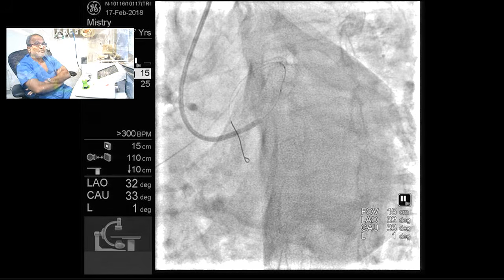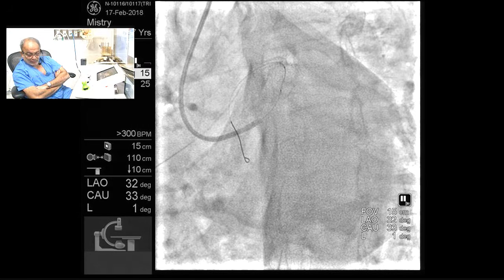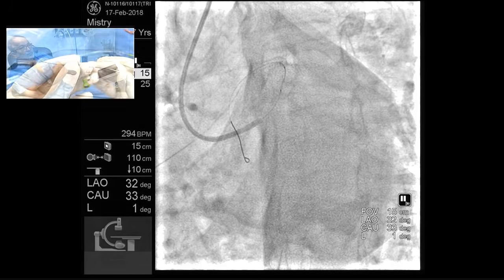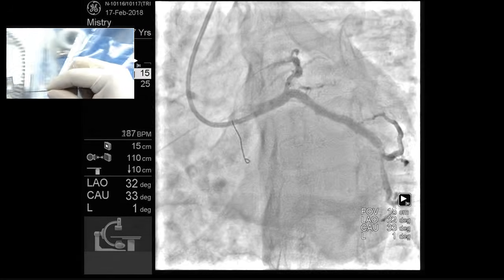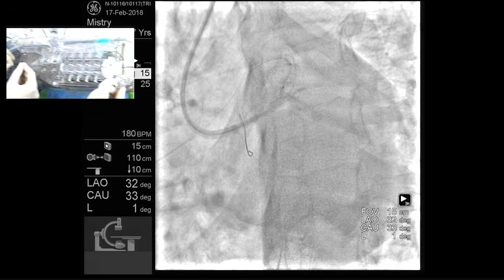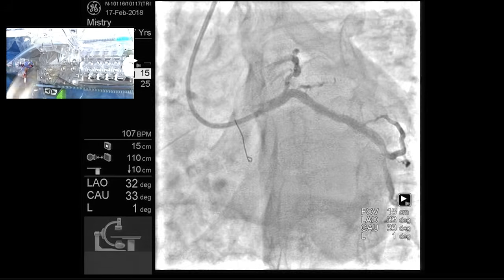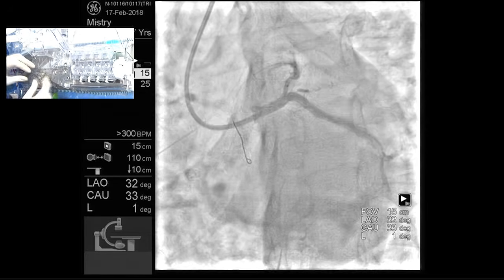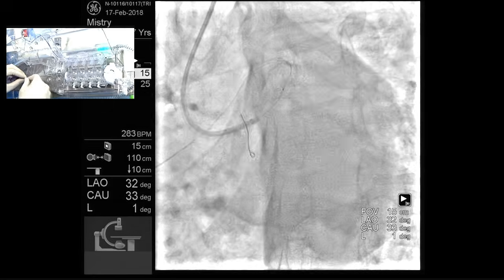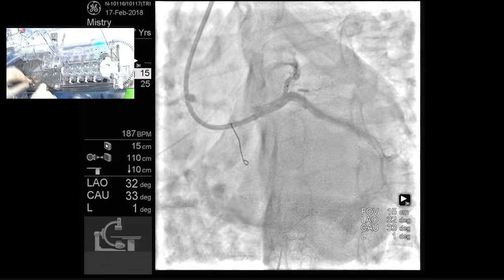So while we are waiting for loading of the stent, what do you think about revascularizing all diseased vessels at the time of primary PCI versus only the culprit lesion, Dr. Patel? Everything at the same time? Yes, that British paper. I am a little hesitant, because if the patient has a tendency for clotting, and the thrombosis happens at more than one place, you are in deep trouble. Even if I want to do complete revascularization in the same hospitalization, I will do the culprit and wait, and next day, or maybe in the evening if everything is fine, I will do the rest.